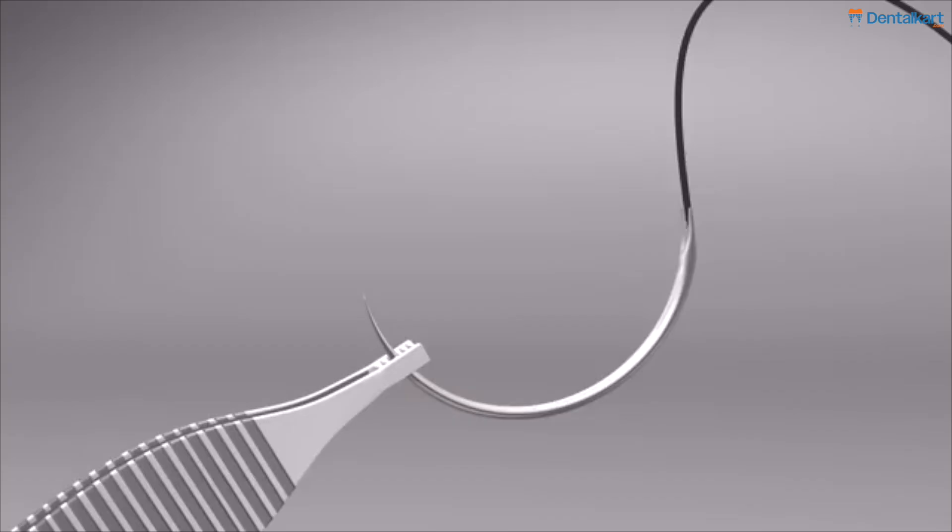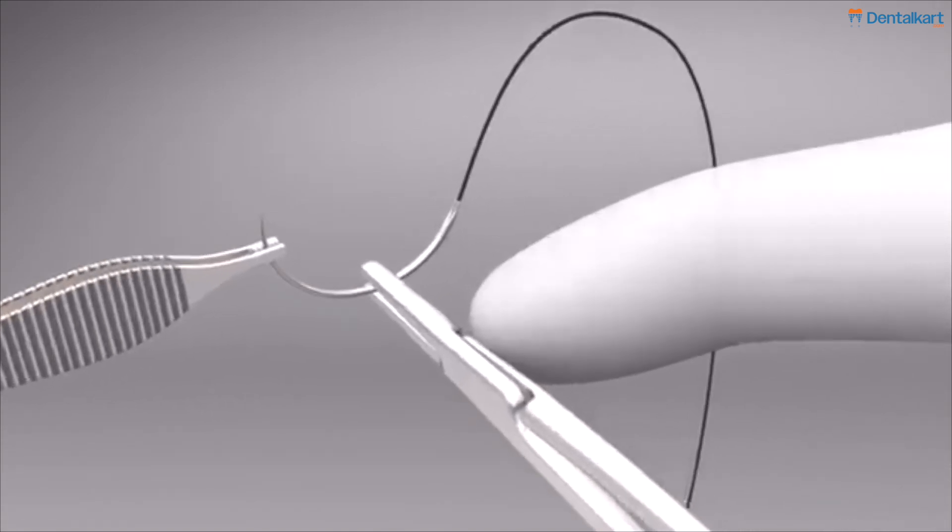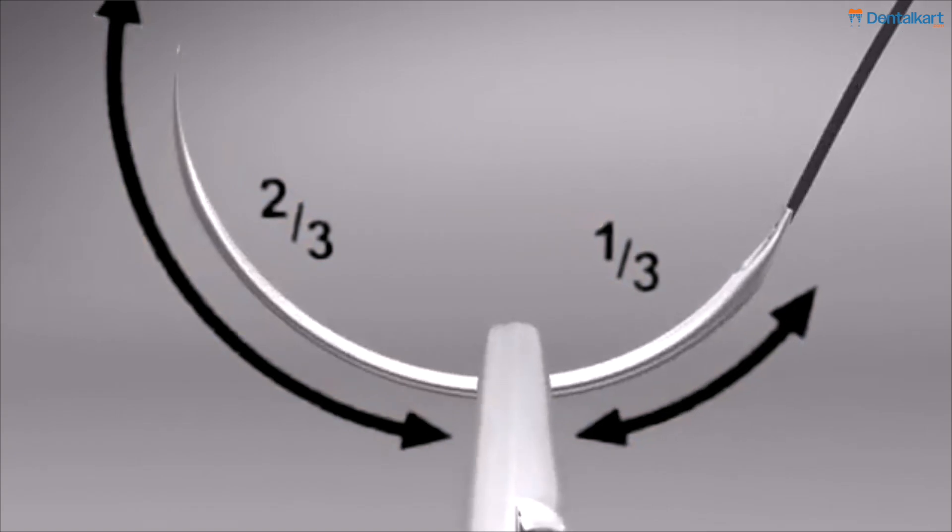Now we will understand where we should grasp our needle from the needle holder. It should be two thirds from the length of the tip of the needle.